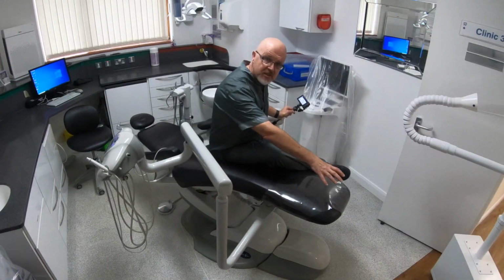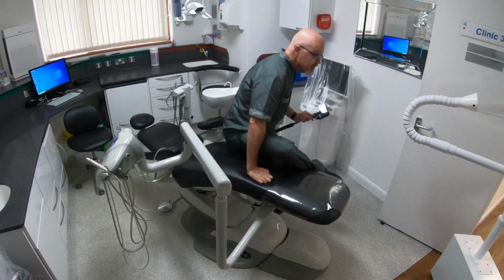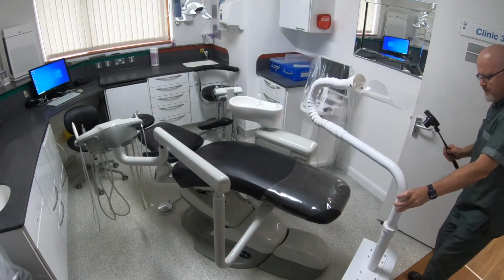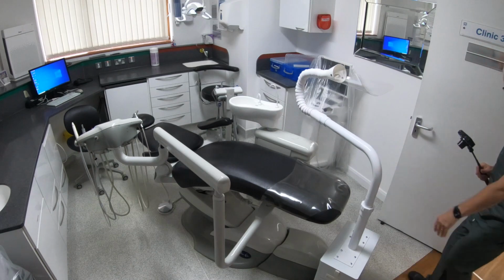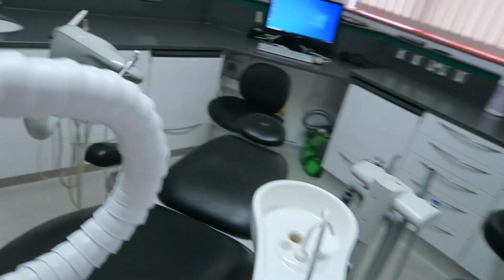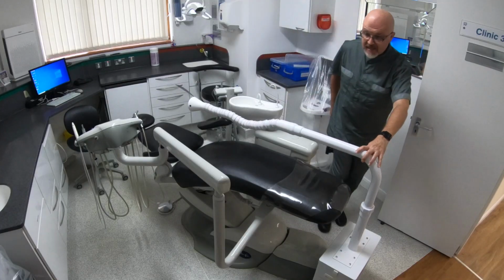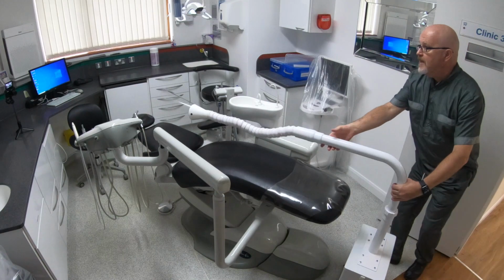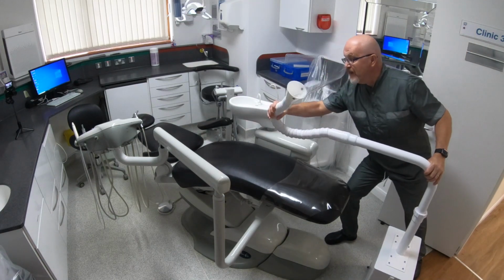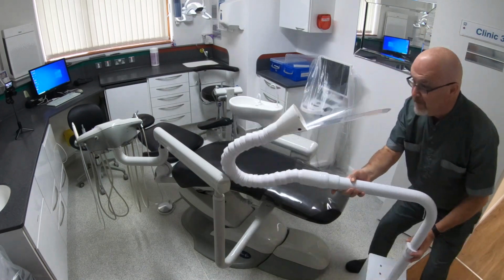The ideal position, of course, is at the base of the chair there, but the reach at the moment simply isn't sufficient. So if it was at the foot of the chair like this, in there, and if it reached, which it doesn't, so it's in the park position at the moment, swing that across, bring that down like so, and of course we're well short. As it stands, what I'll do then is I'll just put it into the place where this is going to be hopefully workable as it is.